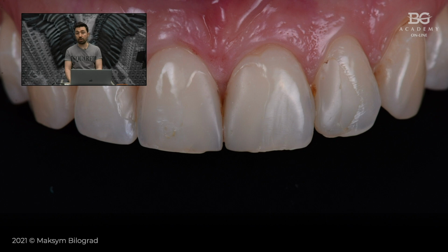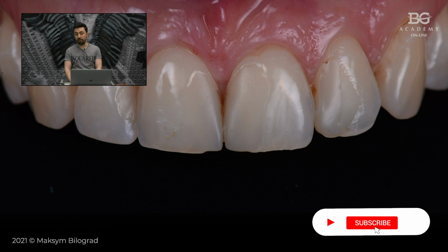She would like to change these restorations for new ones, and also she asked us to keep her color, so she didn't want to make this whiter or darker, and that was why we decided to go for direct restoration rather than ceramic veneers. Okay, and we also had some caries defects that we had to treat during this case.